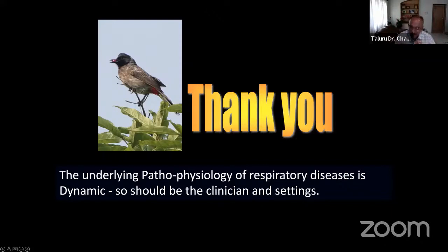But you can't compare SIMV and adaptive support ventilation. If somebody is interested, just send me a hi on WhatsApp. I'll send you the slides of ASV so you can understand. Or else, if time permits, next time I'll add 1 or 2 slides and explain the difference. But you can't compare the two. ASV works on a minimal work of breathing principle. SIMV works on a myth that if you put mandatory breaths, the patient will be rested, which they won't. You'll be fighting the ventilator at that time.